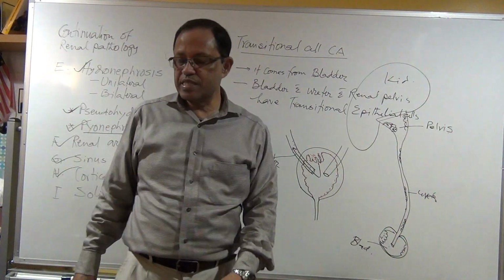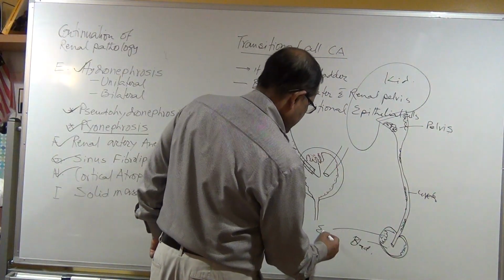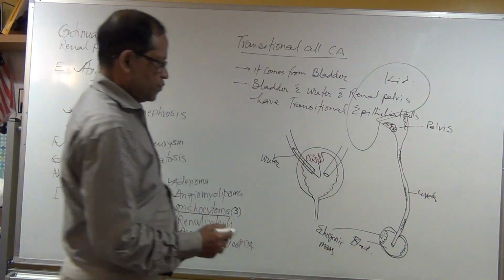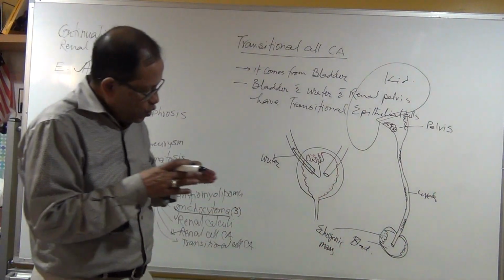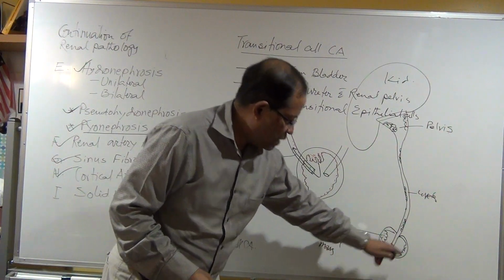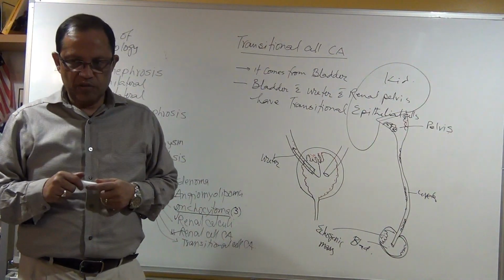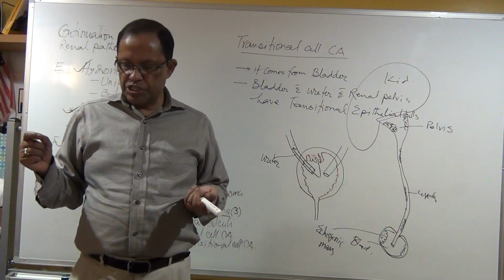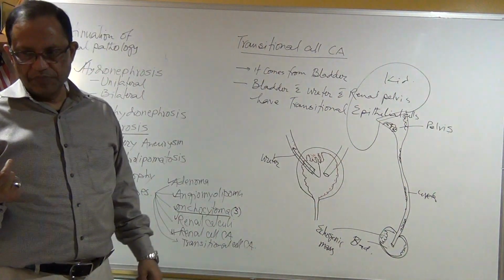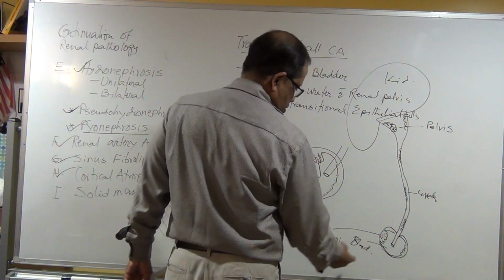Then you will see what? You will see a hyperechoic, echogenic mass protruding towards the inside of the bladder. And it is usually not in only one place, but more than one place. Hyperechoic mass and wall thickening. Normal wall thickness of the bladder in distended condition should not be greater than 3 millimeters. But here you will see it is thicker, irregular structures and echogenic.